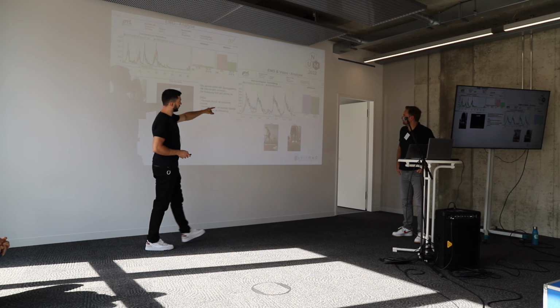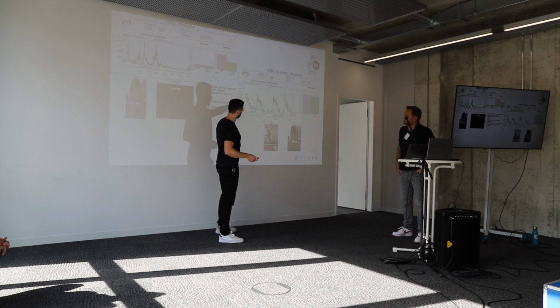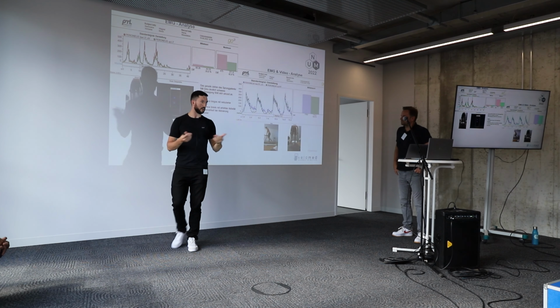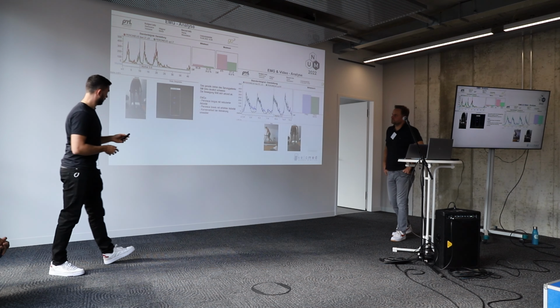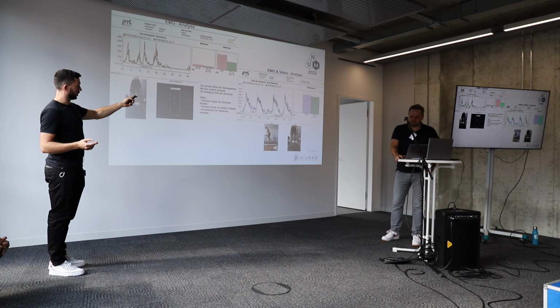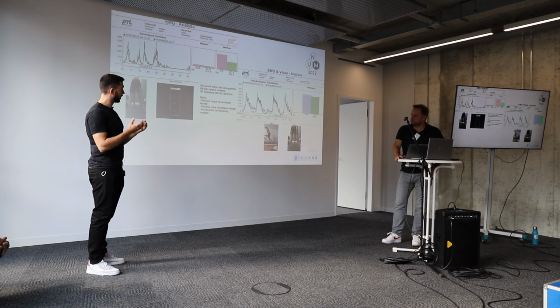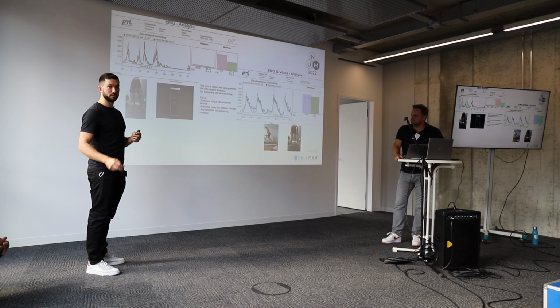And on the other side, on the healthy side, I would say it is normal, it's the not injured leg, so there's no difference between these two muscles.